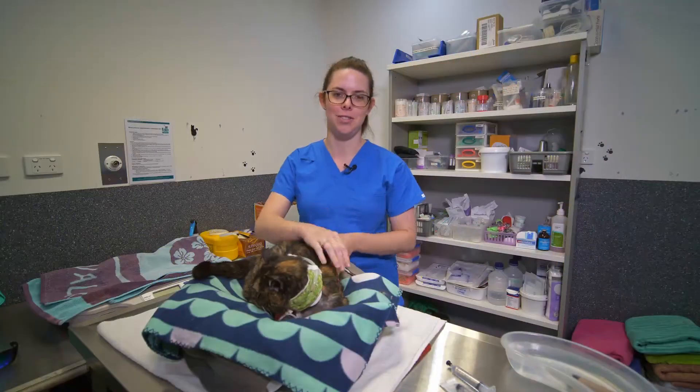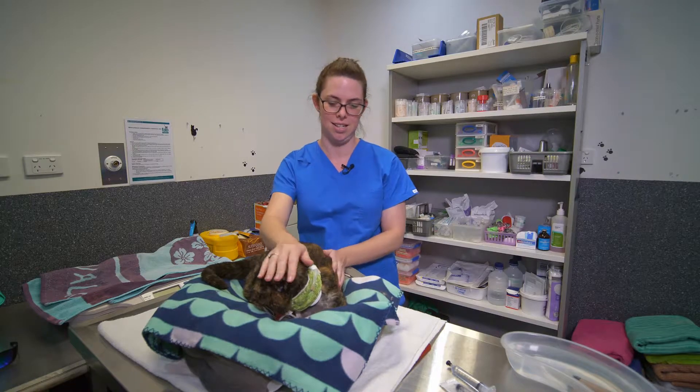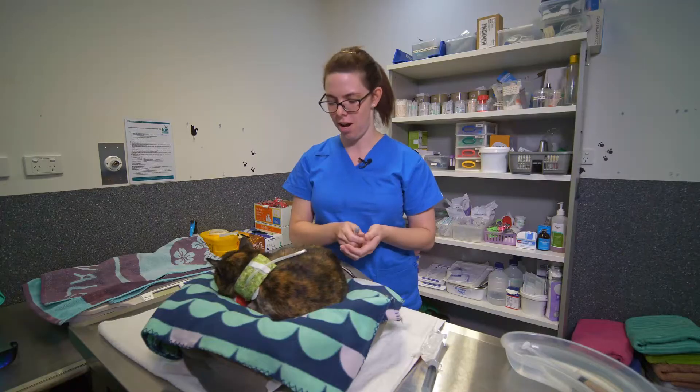Hi, I'm Natalie, one of the feline nurses working at Veterinary Specialist Services. Today we're going to show you how to tube feed a cat. This is our lovely girl Missy.